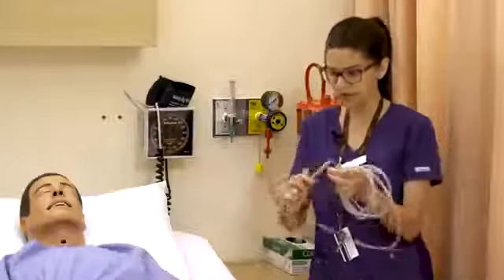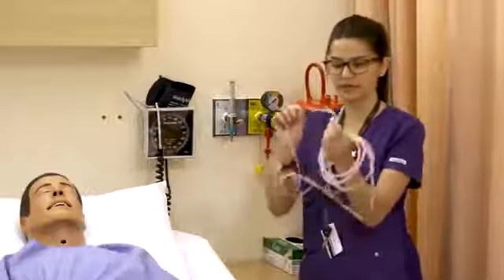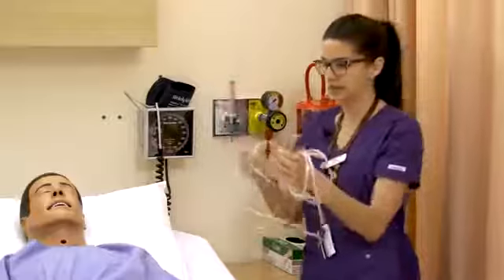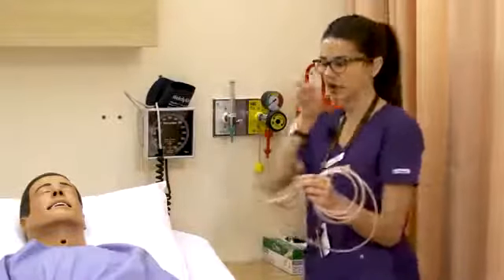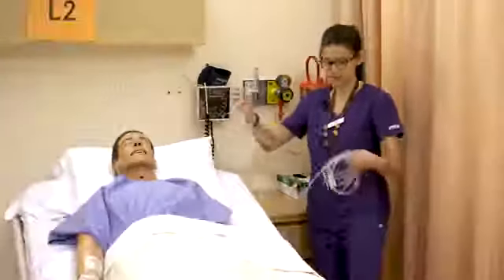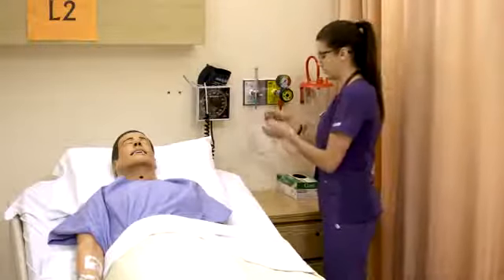So they look like this, that fork look or that prong look, and you might notice that they're a little bit curved. So they curve like this, and we want the curve to go into the face. So not out towards the tip of the nose, but into the face on the person. So we'll hook up our nasal prongs here.